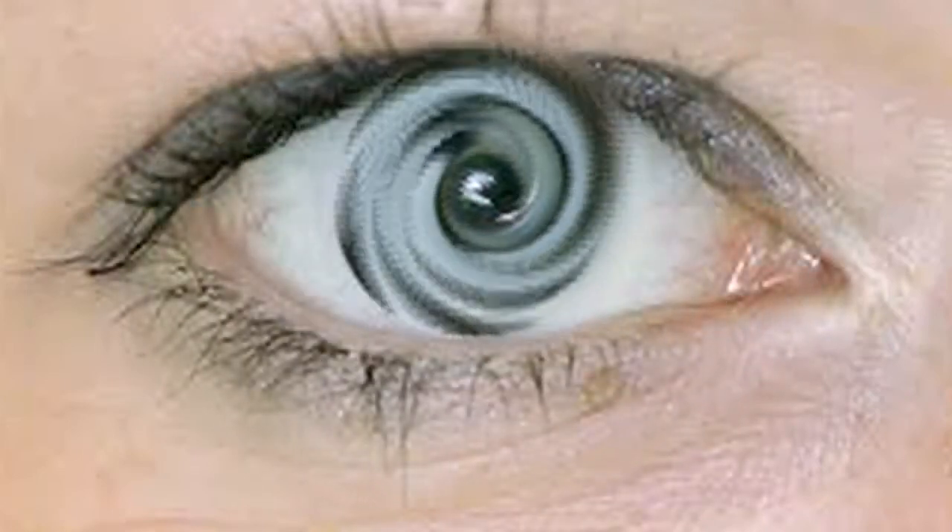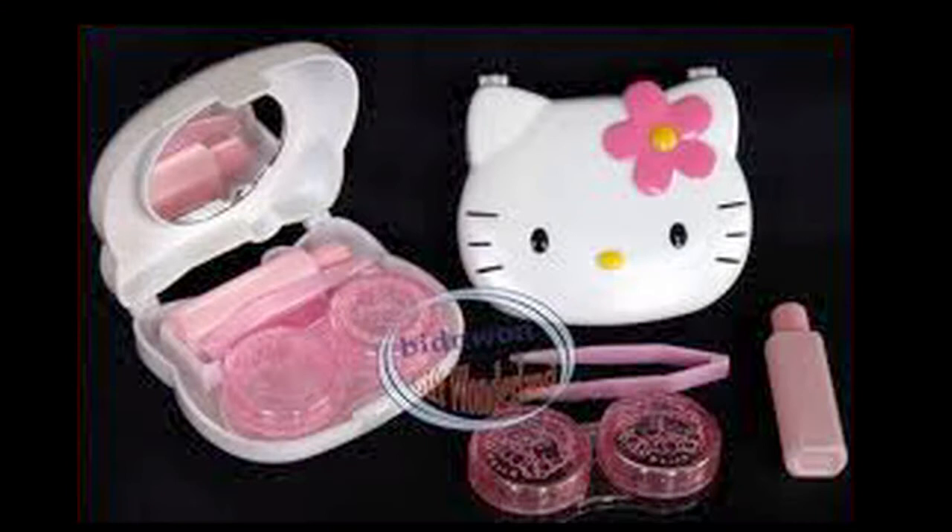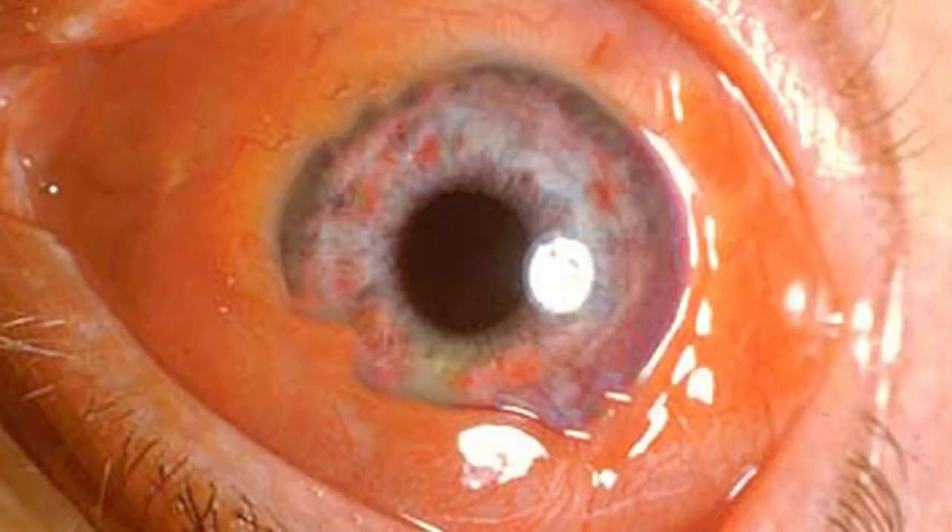Believe it or not, there are still people out there who wear hard contact lenses. Most of these are newer gas permeable lenses for complex ocular corrections that can't be fixed with a soft lens. Because these hard lenses adhere to the cornea by a vacuum effect but can't be bent, they're really hard to remove, especially from an injured chemotic eye.